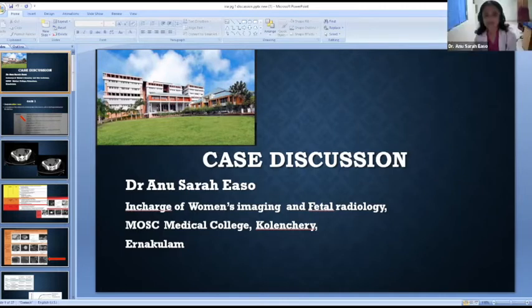So as you said, O-RADS helps us to categorize the lesion and tell the clinician how to manage the lesion further. Depending on the nature of enhancement of the lesion on a time intensity curve, we can say whether it is category 3, 4, or 5.